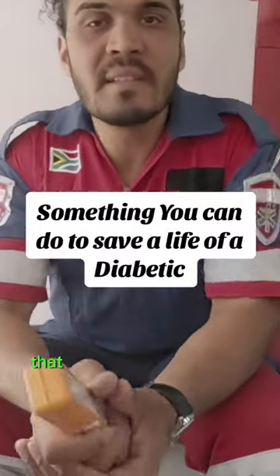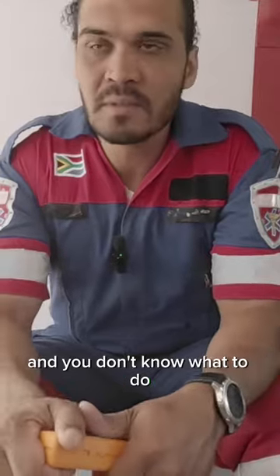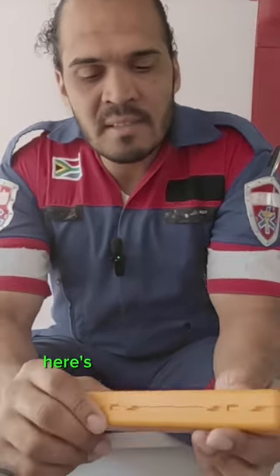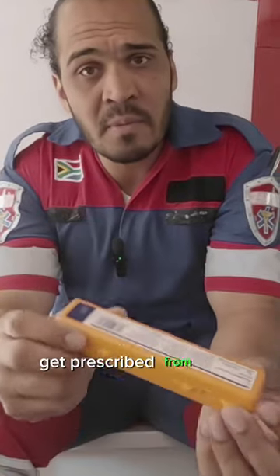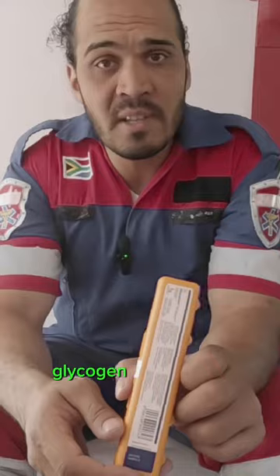If you have a family member or friend that is diabetic and they've been unconscious and you don't know what to do other than calling the ambulance, here's a kit that you can actually get prescribed from your doctor. It's called the Hypo Kit, the glucagon Hypo Kit.